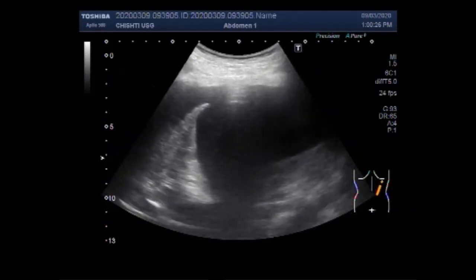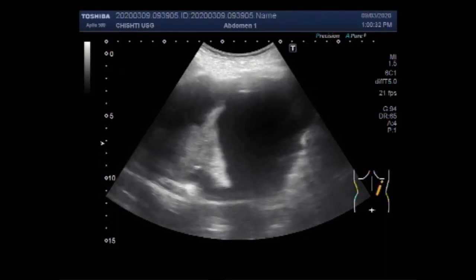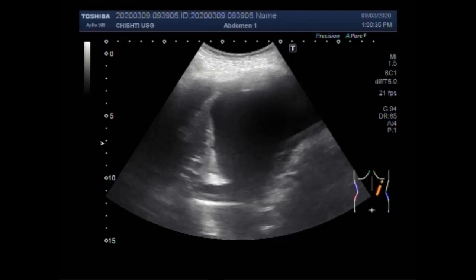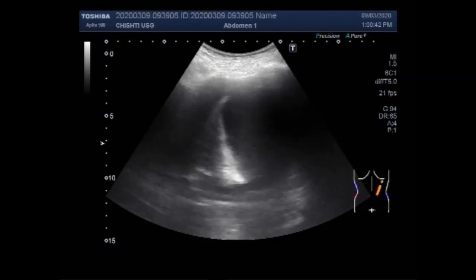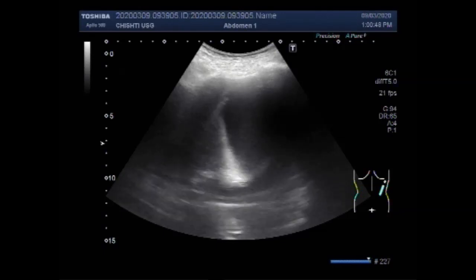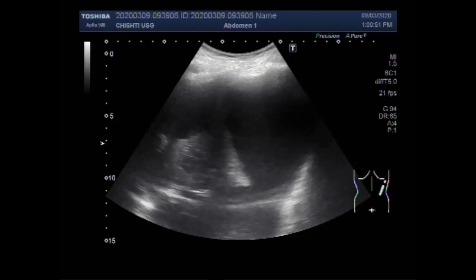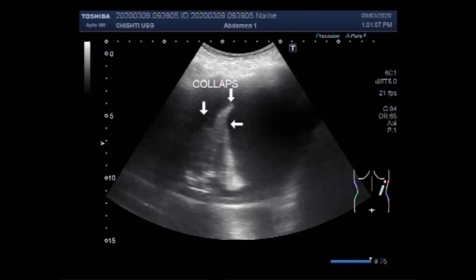Again you can see the picture of the patient in the prone position. You can see the movements of the collapsed lung tissue with the respiratory movements. The collapsed lung tissue is moving to and fro in the pleural fluid. In this patient there was only right pleural effusion. The left side of the lung was clear.